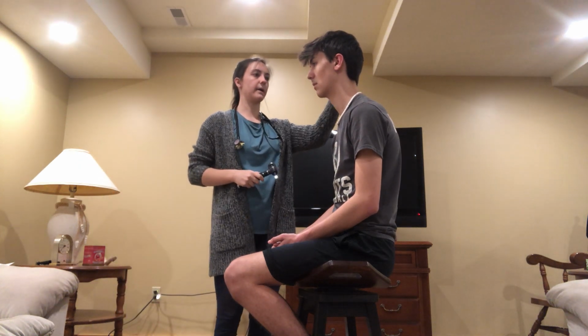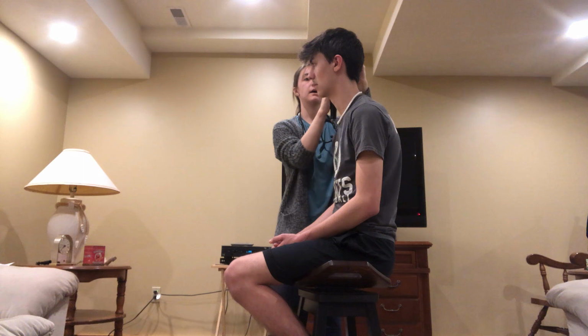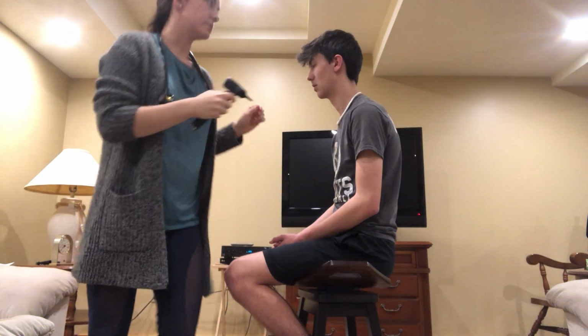By pulling up and back on the auricle, I'm going to stabilize my hand using 3 points of contact against my patient's head, and I'm going to insert the speculum. I'm going to note the external canal if there's any obstruction, exudate, or erythema. I'm going to look for the cone of light and look for any tympanostomy tubes. And I'm going to note that the tympanic membrane appears patent and there's no bulging or erythema. I'll do the same on this side.